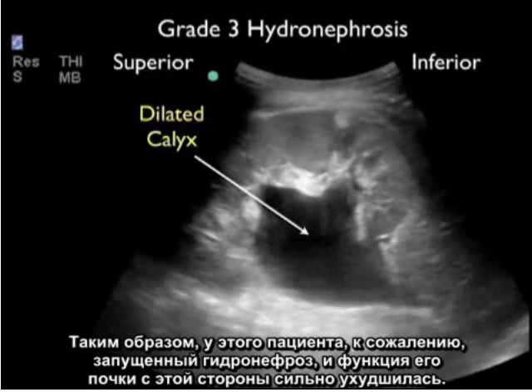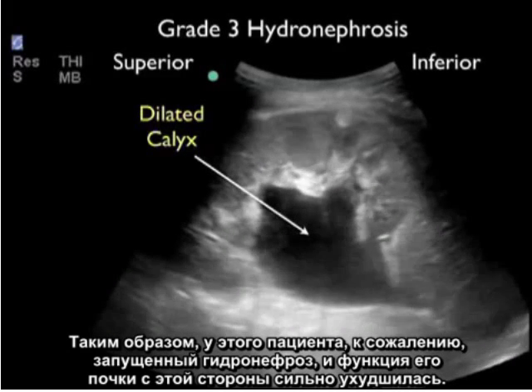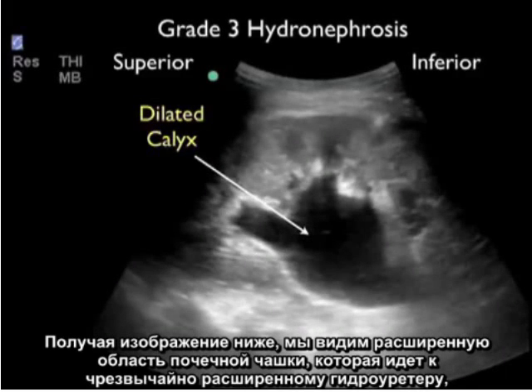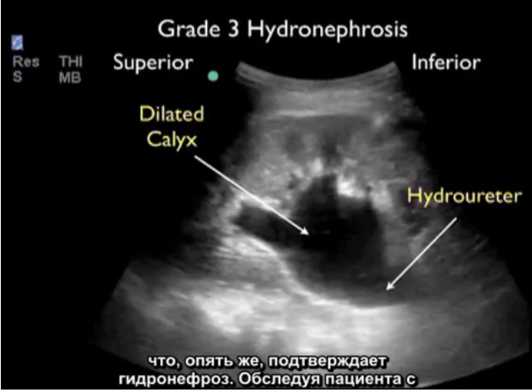So unfortunately, this was a patient who had a long-standing hydronephrosis and who had lost a lot of the kidney function on this side. As we still the image down, we can see that the dilated calyceal region leads to a very dilated hydroureter, again confirming hydronephrosis.